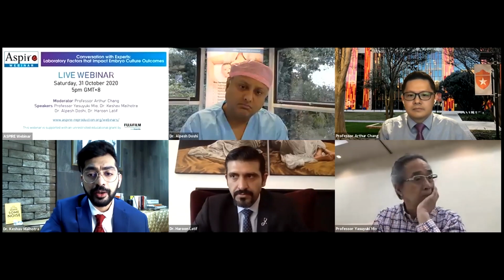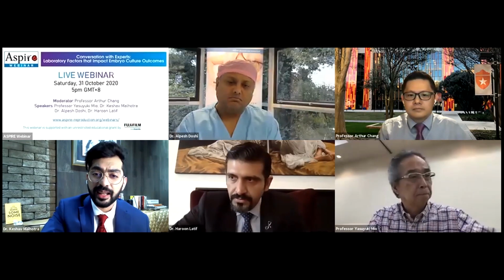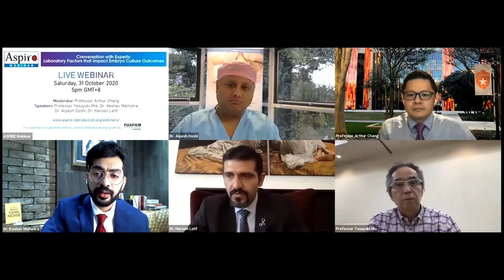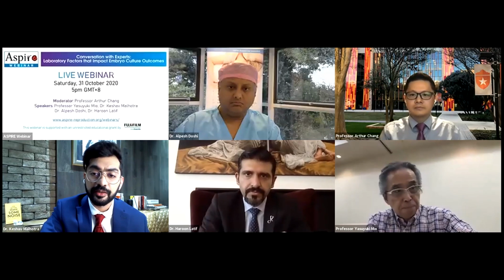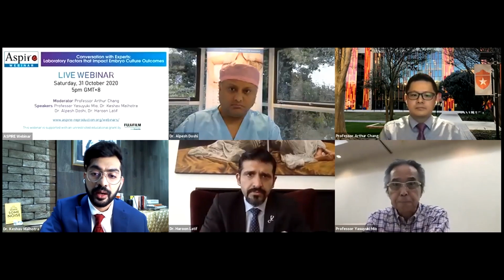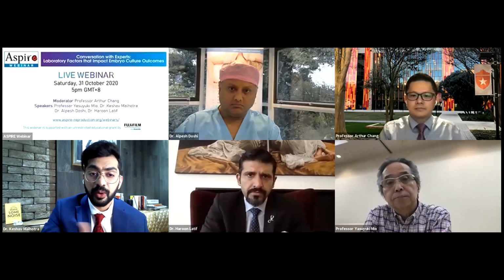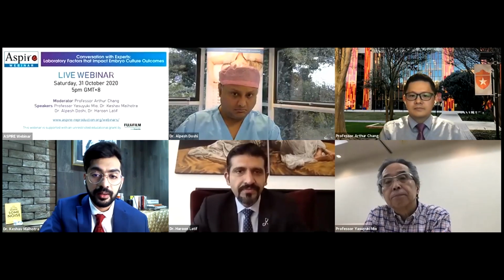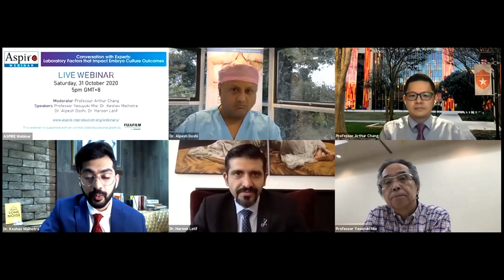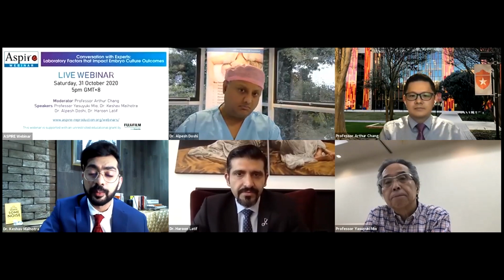So if I talk about developing countries, and that's one of the areas where people tend to save up on vitrification kits and vitrification media. In those situations, you might want to create smaller droplets, but I would not recommend going below 200 microliters. That's my personal preference. I would not want to do that, even if I'm doing it at room temperature.